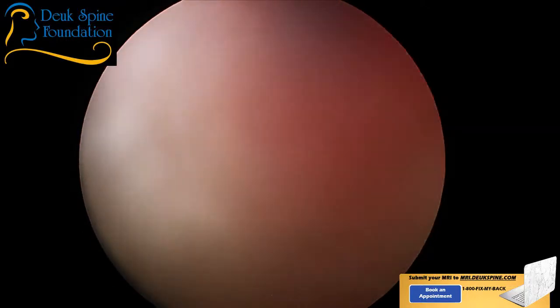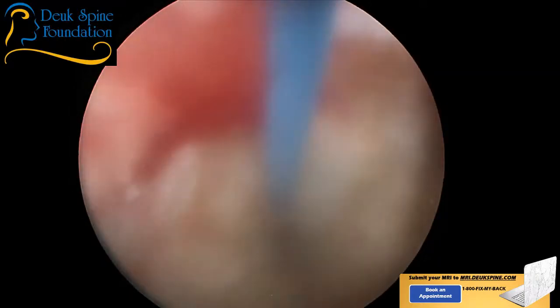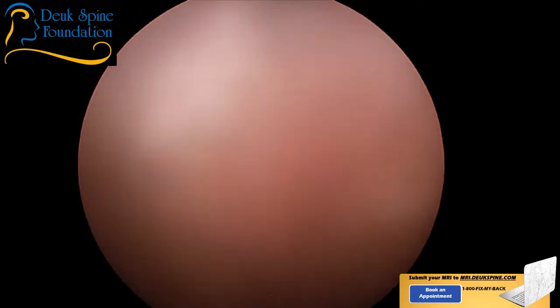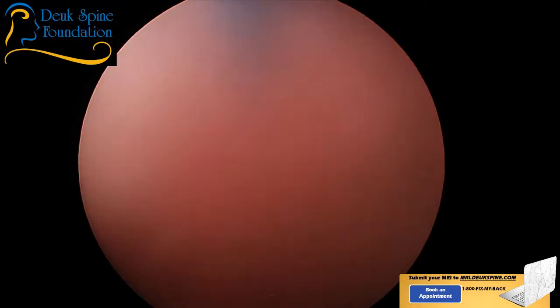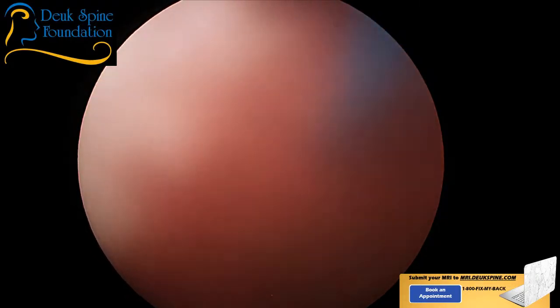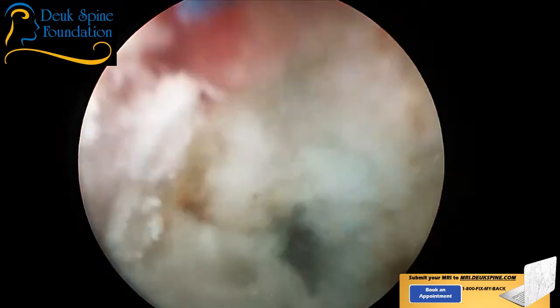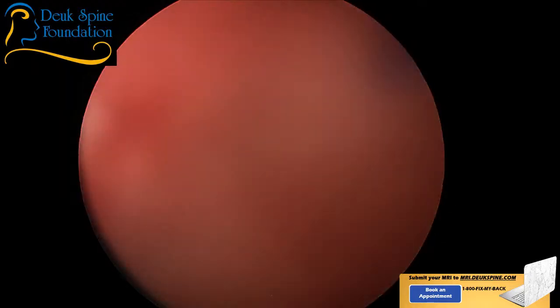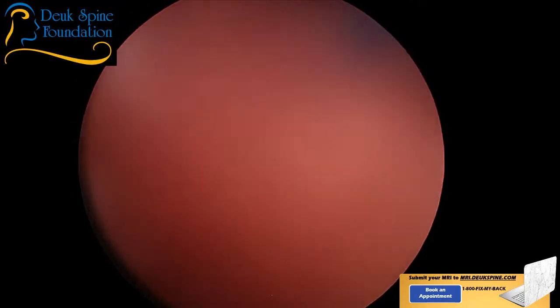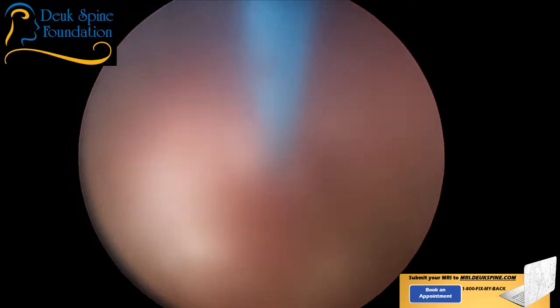Just about done. That's the end plate to the left, end plate of 5. We have a little fumarole down here. Anybody know what a fumarole is? Let's see who has some training in marine biology. The fumaroles are at the bottom of the ocean.